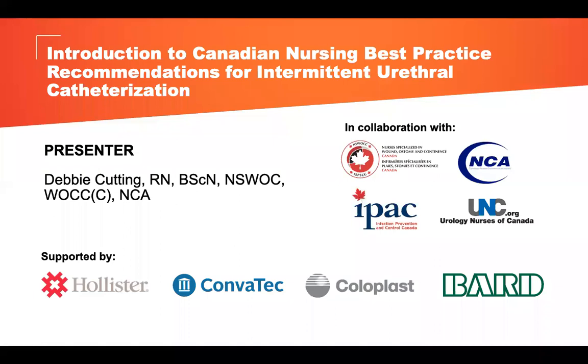There have been a few studies looking at boiling catheters, soap and water, and alcohol sterilization. The current leading recommendation is simply warm to hot water with soap, like dish soap, and allowing it to air dry on a paper towel on a cabinet. The problem is that if you're on the go, like a patient, and you clean it in a public washroom and throw it into a Ziploc bag, it doesn't get a chance to air dry. Presumably something that's wet is more likely to form things like mold. So that's a consideration. But generally speaking, soap and water under a warm sink and allowed to air dry is the recommendation for cleaning.